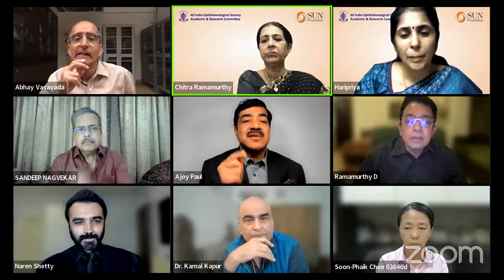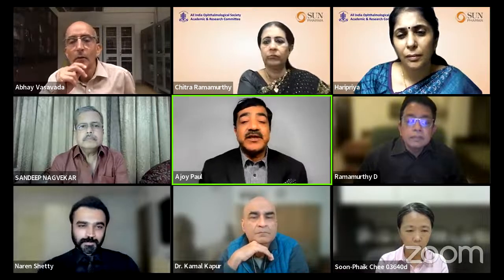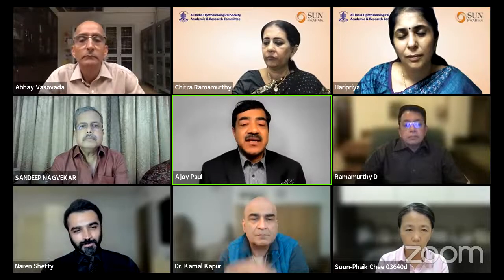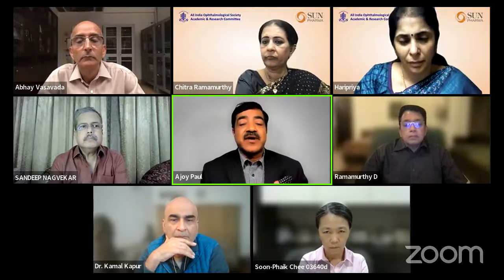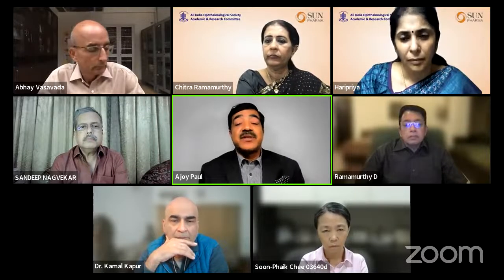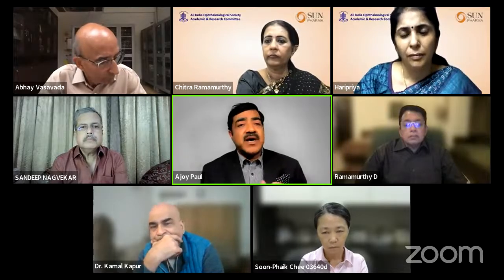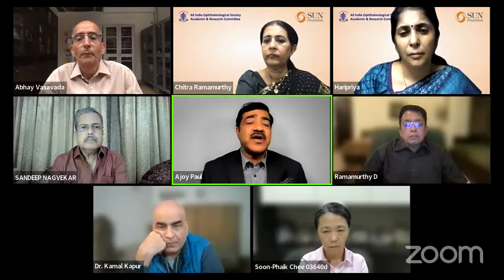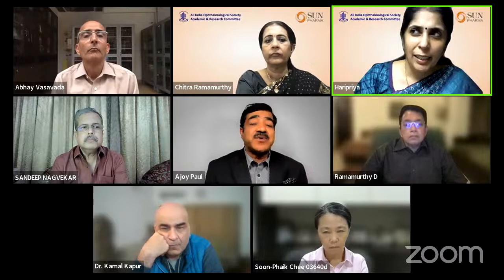Dr. Ajay? I just wanted to ask Haripriya, I think that's a wonderful technique that you fixed the lens in the iris, but I just have a concern. Except for the Sensar lens, almost all lenses have an anterior curved surface, I mean anterior curvature, at the margins, especially the Alcon Acrysof and many other lenses. They could be rubbing in the long term, because you have done quite a few cases. So what is your long-term experience? Is there any pigment dispersion?